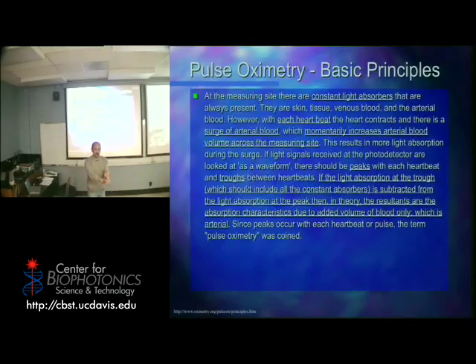They might have had a little device measuring light absorption, taking the blood as they're measuring it, then sticking it in the machine a few minutes later, getting a reading, and they had to figure out what change in light absorption corresponds to a certain percentage of oxygenation. And they probably had to do that with thousands of people to validate this device, to make sure that the values they were getting were accurate. Okay? They might have done some of this in the operating room too, because they had an easier time getting access to the blood.